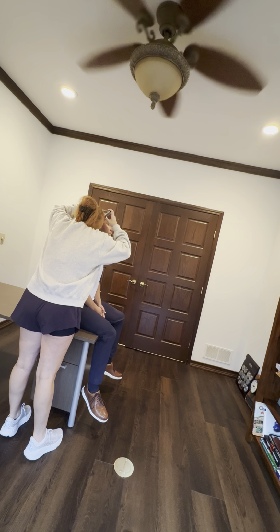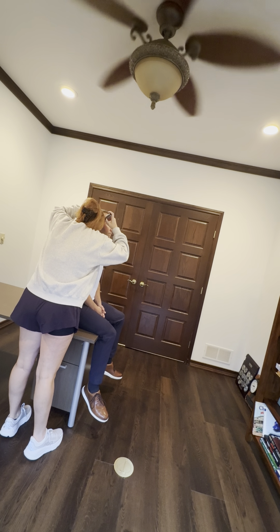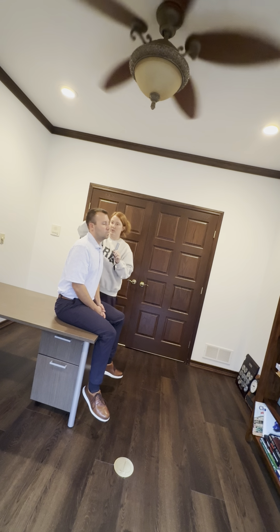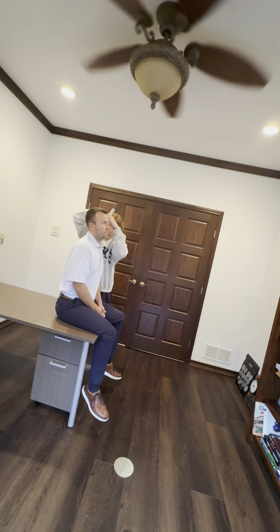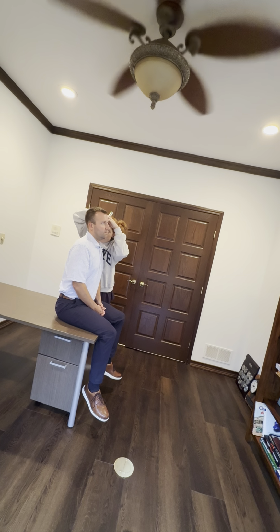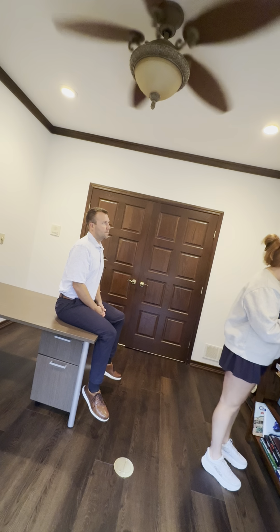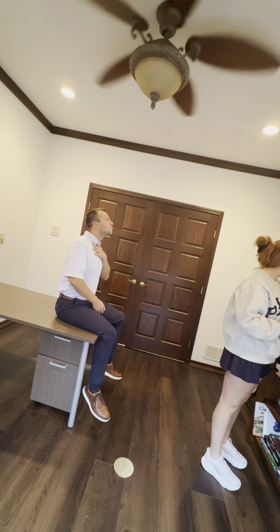Looking inside the ear canal, nice and clear. And I can see the tympanic membrane, it's intact, no excessive redness, and I can see you have a good cone of light. And then for this side, I'm going to switch hands to my left, hold up with my right. Again, you can see the ear canal to the back. Looks good back there. No redness, no swelling, no drainage noted. Ear canal is intact and the tympanic membrane.